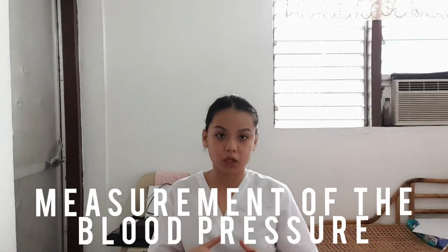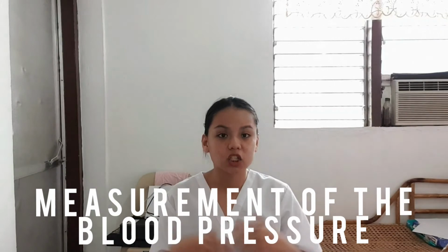Show how to measure the blood pressure. But before anything else, I should prepare my equipment. The equipment that I need are my aneroid sphygmomanometer and my stethoscope. So I have to ensure that my sphygmomanometer has no damages. For the size of this, it is as what the box says, it is the standard size cuff.